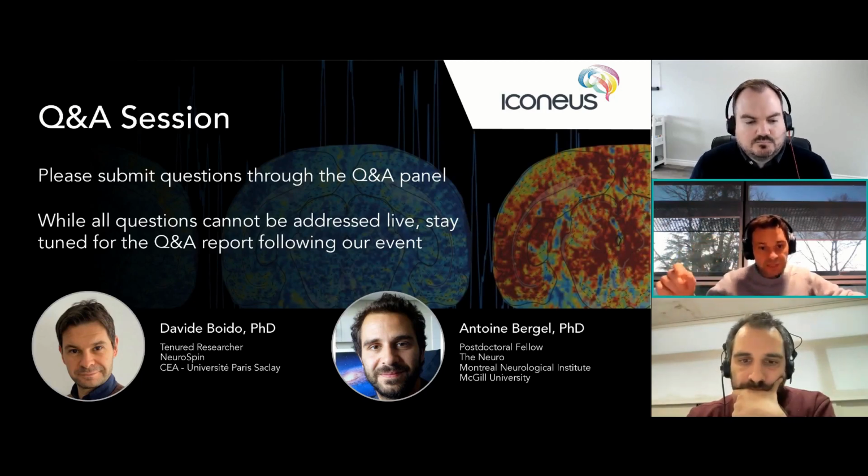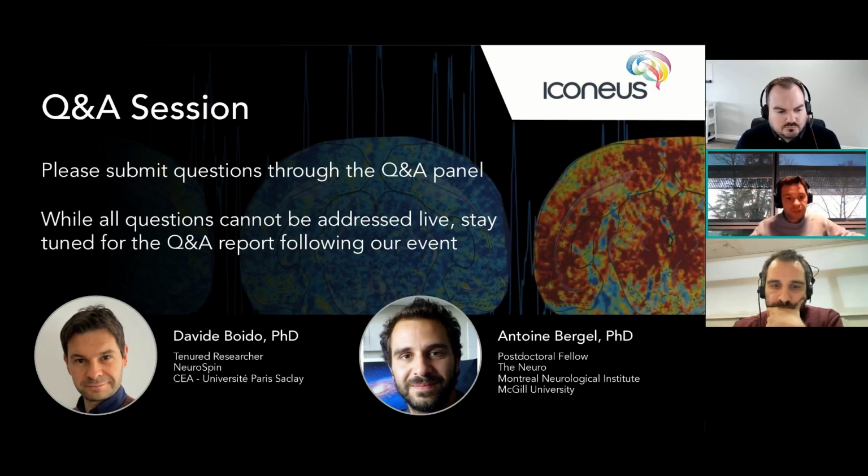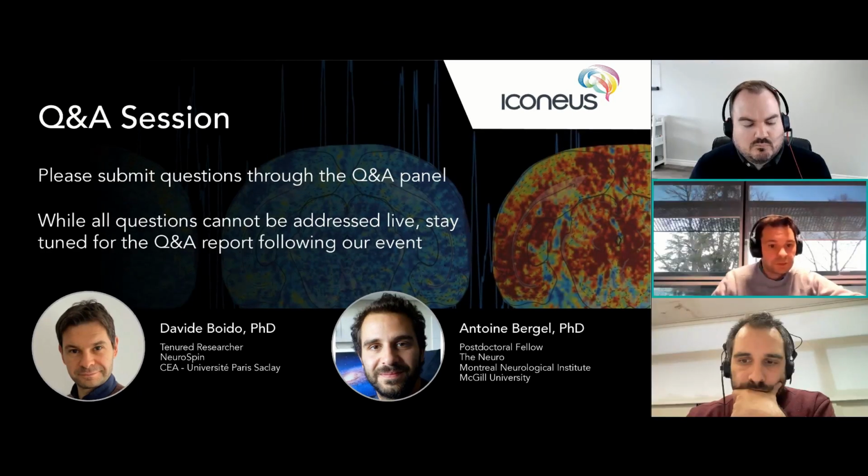What is actually linear is the neurovascular coupling, I recall. It's not the relationship between the stimulus and the vascular response. It's the relationship between the neuronal and the vascular response. So that is the tricky point, and we should really pay attention to that. The good news is the neurovascular coupling is linear, at least in our condition, and in many other conditions that we could test in our paper. But please don't take just the boxcar to rule out information about the linearity of the brain.